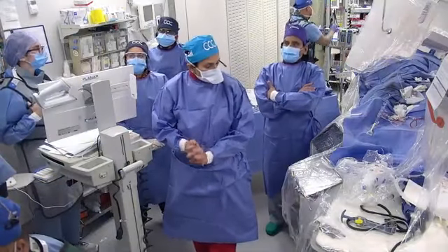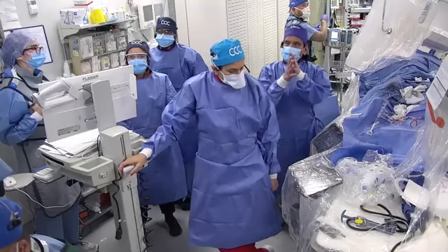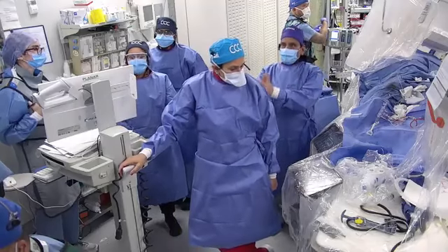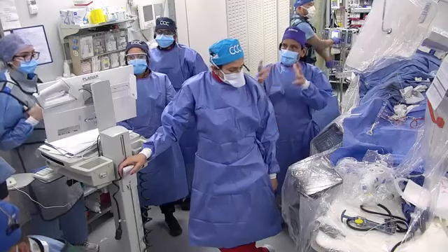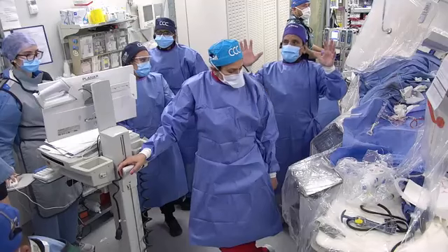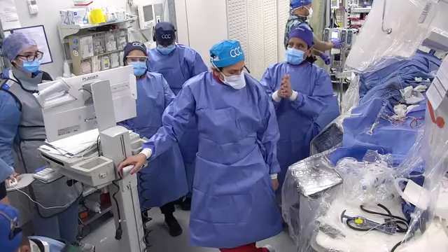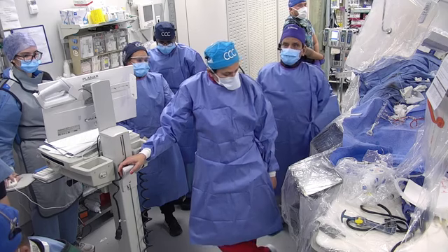But if you have done a lot of pre-dilatation and pre-plaque modification, we have used rotablation, we have used the cutting balloon, so we have done all the pre. For the post, at 12 to 16 atmospheres the stent is fully expanded, good lumen, you're more than 7.5, your work is done. If an area is not expanded, you'll go and post dilate that area, but we didn't find any of them.